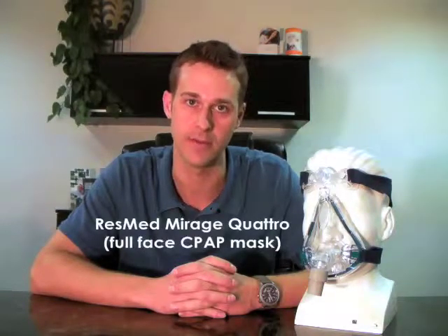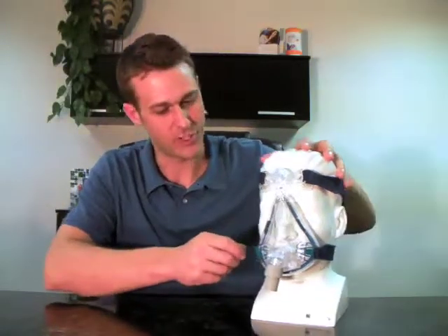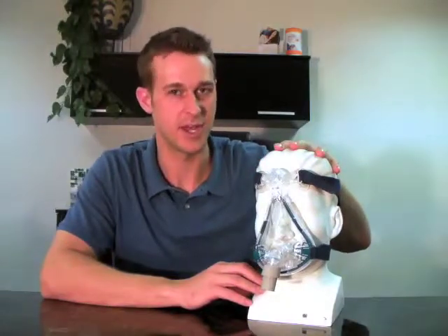Hi, I'm Ryan McDevitt from Sleep Solutions Home Medical in Michigan, and I'm here today to talk about the Mirage Quattro mask, which is manufactured by ResMed. I'm going to use my friend John here to help display the mask. Although John has a plastic head, he is very good on camera.